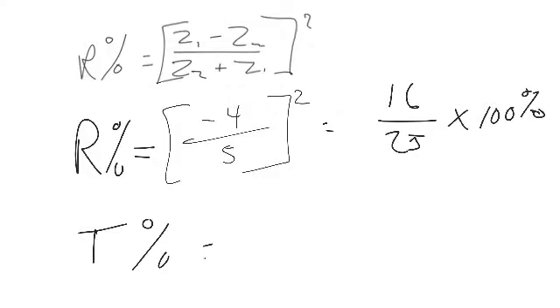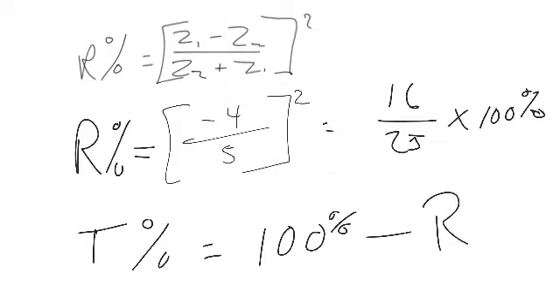Subtract from 100. Yeah, that's right. You take 100% and you subtract what was reflected. It has to equal whatever's left. 100% minus what was reflected is what went through. So the amount transmitted depends on the amount reflected. That should make sense. The amount reflected depends on the difference of impedance. So some sound goes back to the transducer and some continues on to the second medium.